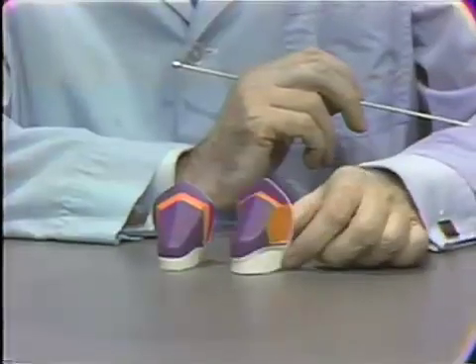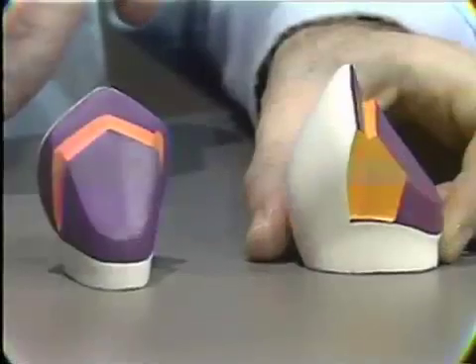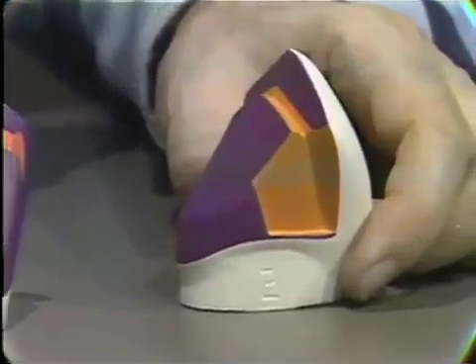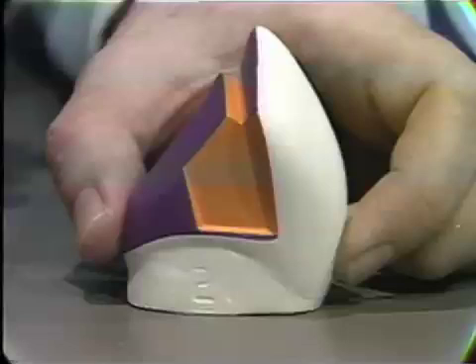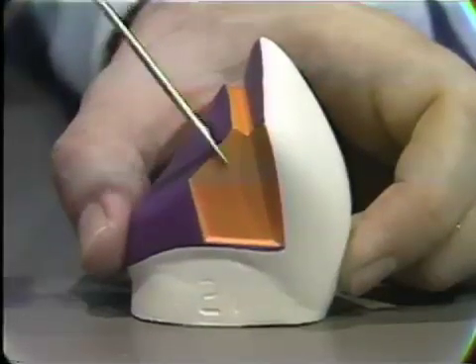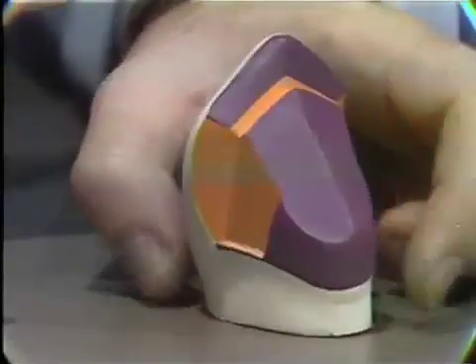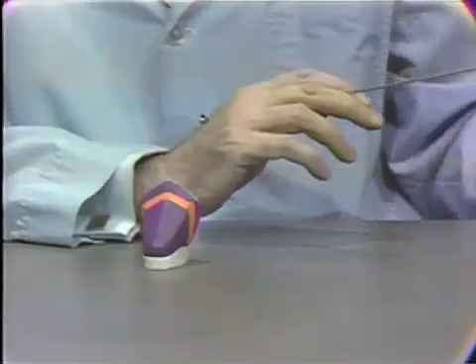Here is a three-quarter crown on a cuspid tooth in which a modification of the box type has been made on both proximals. This might be done where there are mesial and distal silicates which have taken away that tooth substance. It's a modification that's also made if you're going to use a precision attachment type of connector here, which requires a fair amount of room for the placement of the attachment in the retainer itself. So that would be another situation where this type of modification might be made.